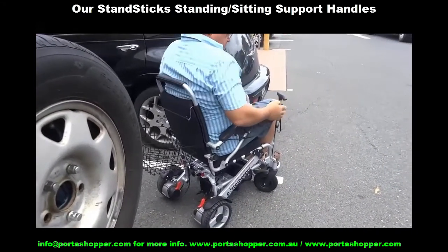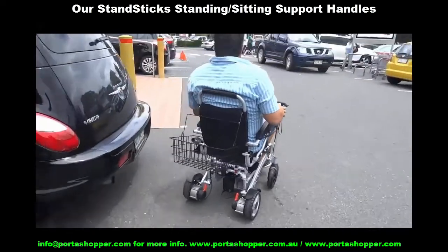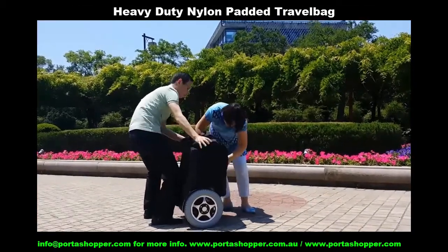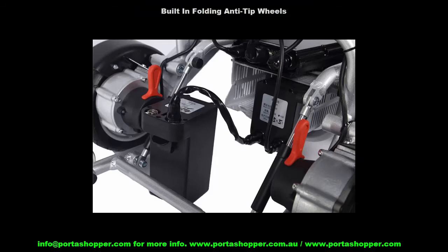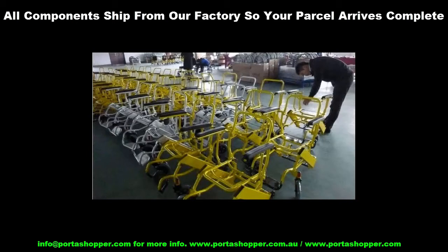All our new PortaShopper MK3 models ship with all these crucial innovations we've developed over the last four years, and we are giving them all away for free to the first 10 clients. Not only that, but you get a free padded travel bag to protect your wheelchair while in the luggage compartment, a free 25-kilogram shopping bag that attaches to the backrest, free built-in anti-tip wheels, and four high-powered magnets that can be stuck onto your wheelchair and your walking sticks with epoxy putty for easy attachment and detachment. All these components are now also manufactured at our factory and will be packaged and shipped together with your wheelchair order so that everything arrives at the same time.